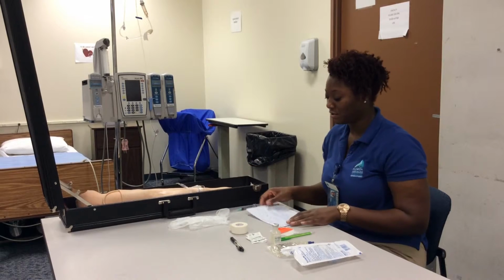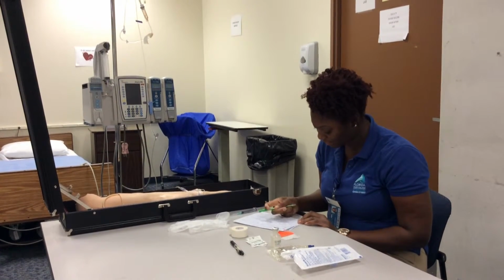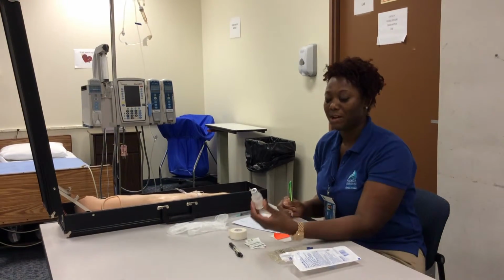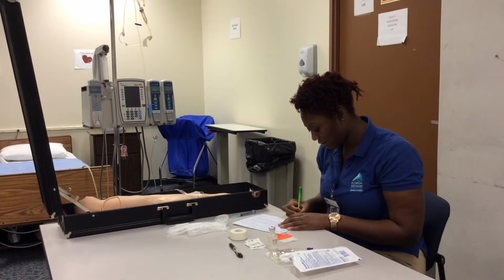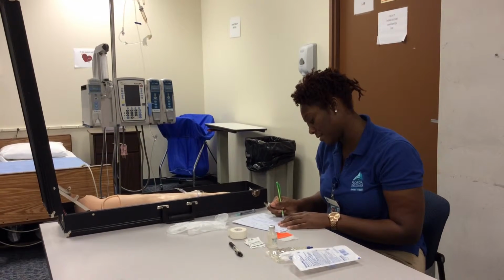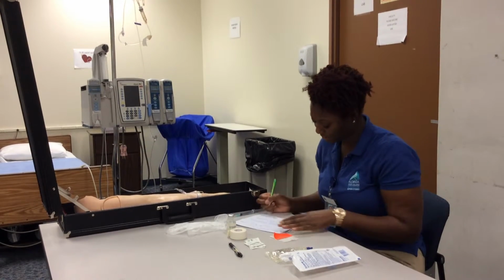So now I'm going to be doing my dosage calc. The doctor has ordered 12.5 milligrams. This bottle states that I have 25 milligrams per mL. So the order is for 12.5, so I'm going to administer 0.5 mLs of Phenergan. And I check my expiration date and my lot number.